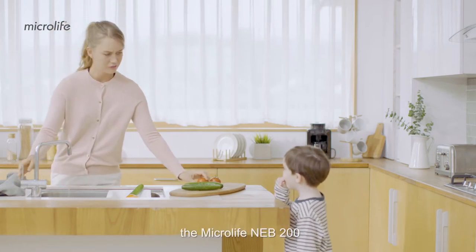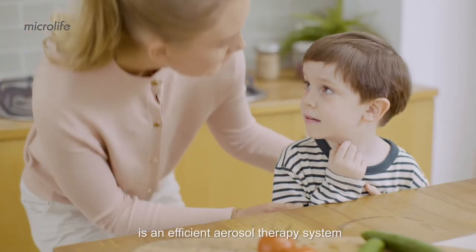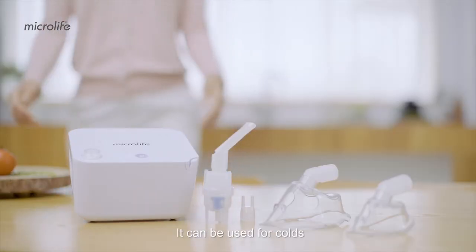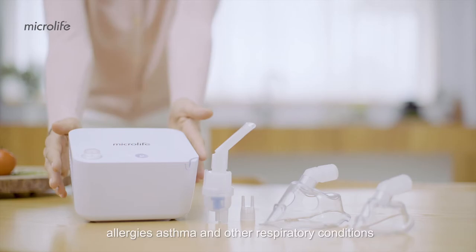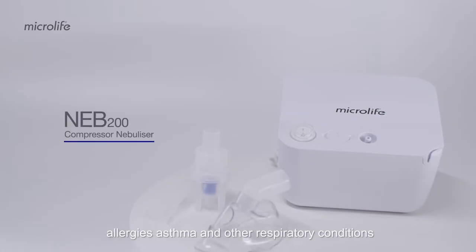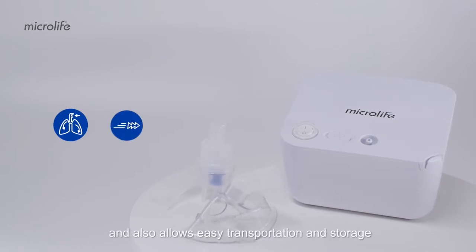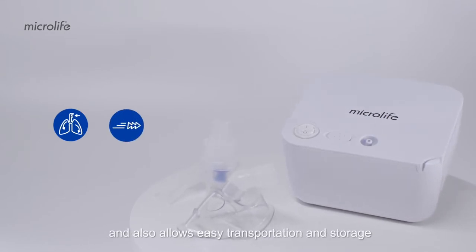The Microlife NEB 200 is an efficient aerosol therapy system for the treatment of the upper and lower respiratory tract. It can be used for colds, allergies, asthma and other respiratory conditions. The compact and easy to use design makes it an ideal choice for the whole family and also allows easy transportation and storage.